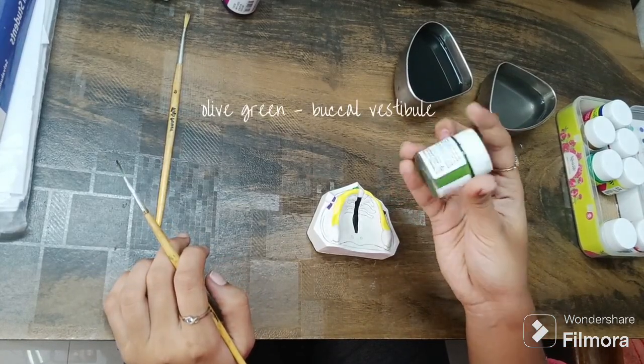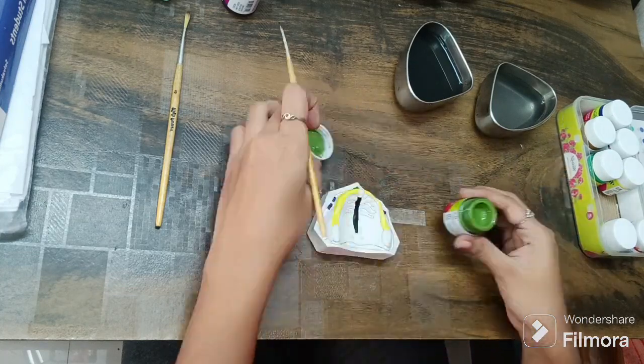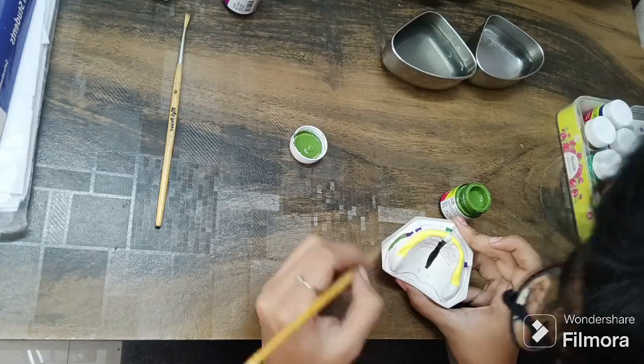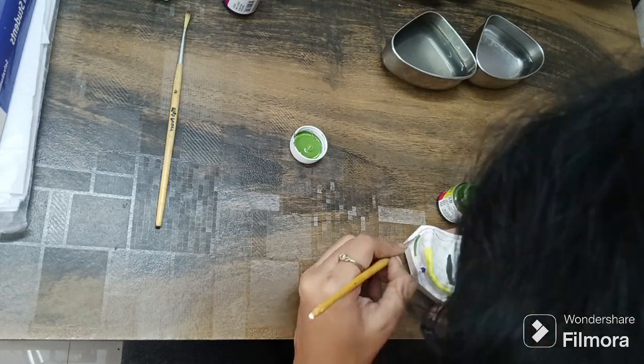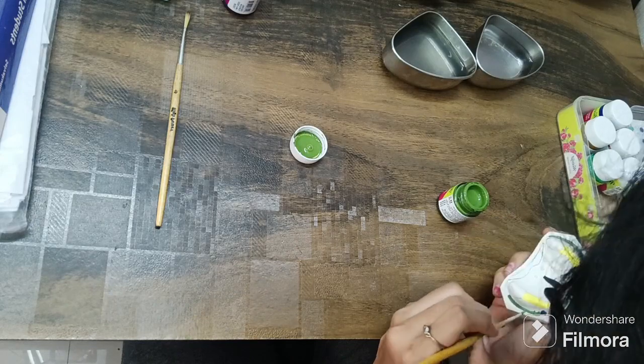I am going to use olive green for the buccal vestibule region. This is the area where you need to be very, very careful — there is a lot of chance for smudging. So please paint patiently. Here I have differentiated the areas well.